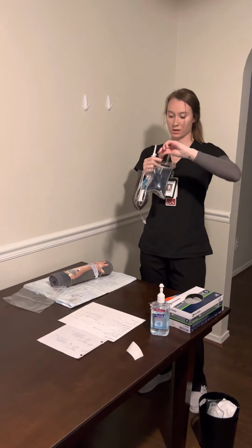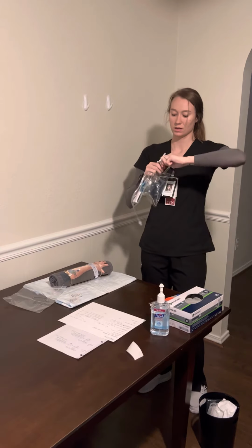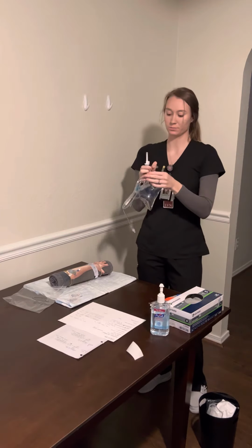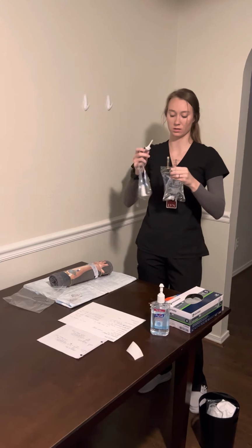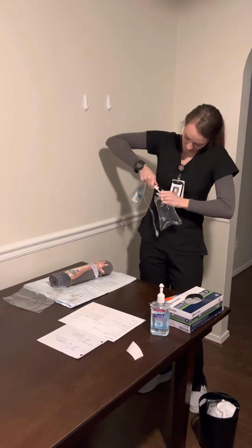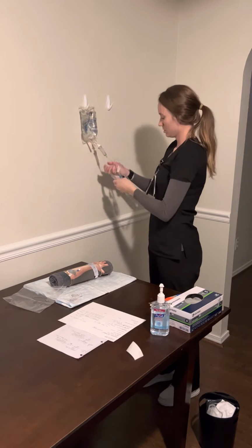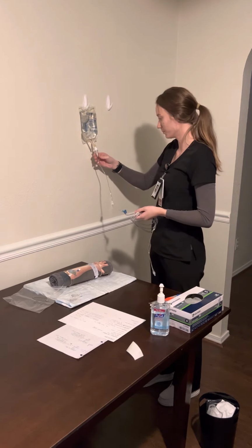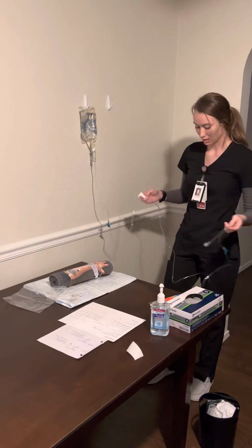I'm going to invert my bag and remove this cap, maintaining an aseptic technique and not touching the port of entry for this bag. And then removing the cap for the tubing, not touching the spike, and put it in there. I'm going to hang this. Squeeze my drip chamber to at least half full. That looks good.